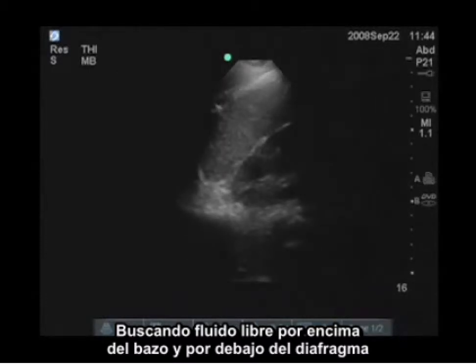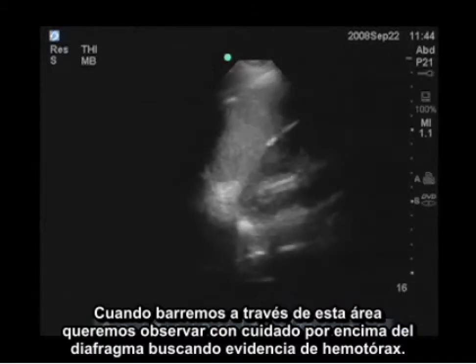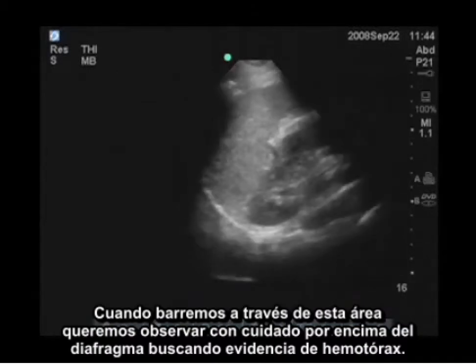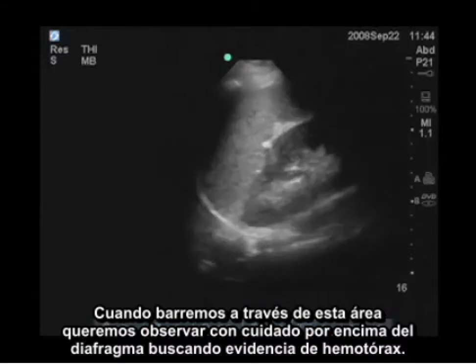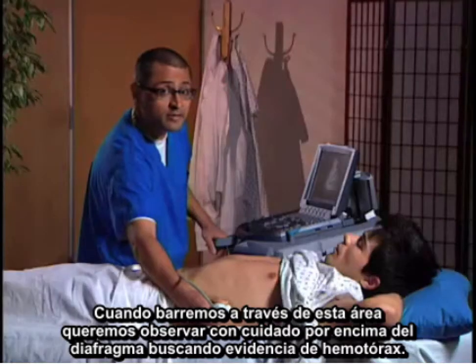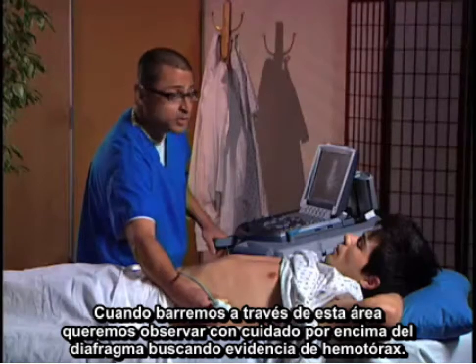When you're scanning through this area, you also want to carefully look above the diaphragm for evidence of hemothorax.